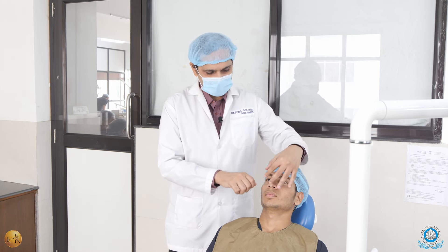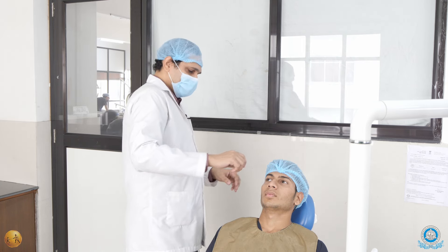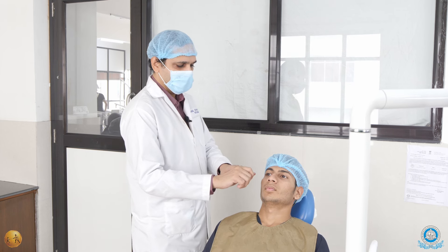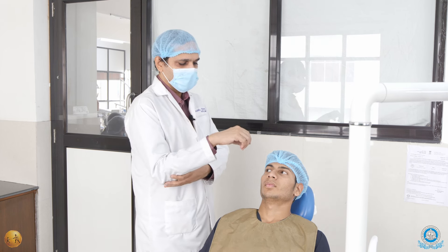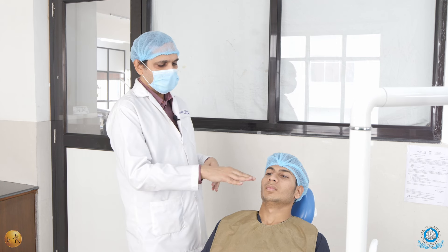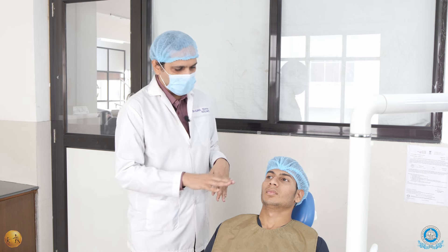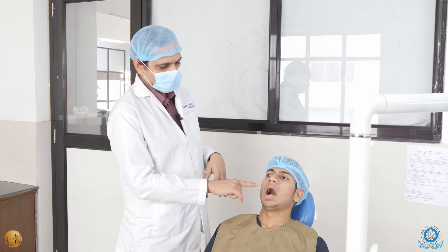As you can see, it is below my elbow level, so it is more comfortable. If it is higher, it becomes a little bit uncomfortable and puts more pressure on your elbow. So make sure that for the lower arch, the occlusal plane is parallel to the floor — open your mouth — you can see the occlusal plane is parallel to the floor and it is at your elbow level or below. That's all about the lower arch.